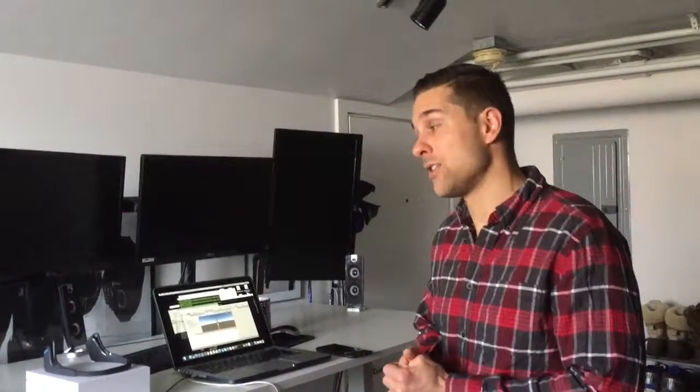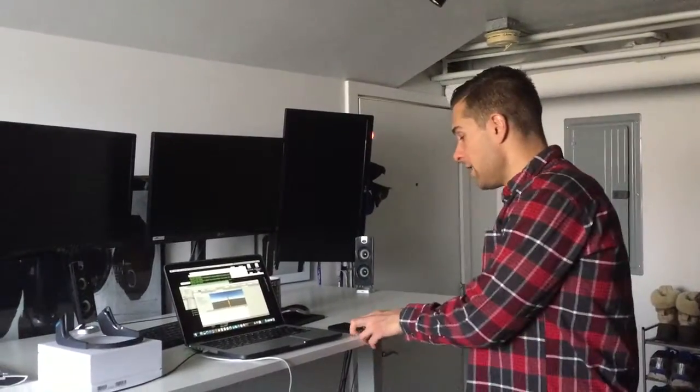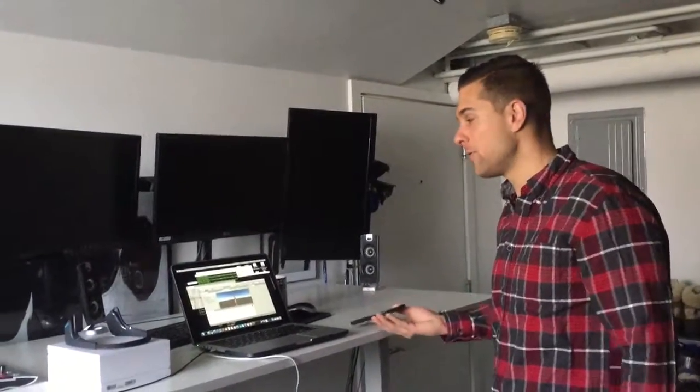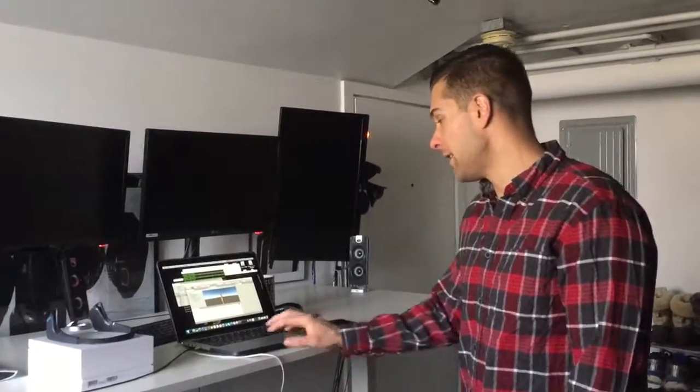The software stack here is sort of complicated. This Muse was supposed to come with an SDK that's advertised on the website. It wasn't until it came in and you go through to download the SDK that it says it only works with the previous model. So I have to use a little third-party app that reads the raw brainwaves, sends it via OSC to a little Muse Lab program that processes it, and that gets sent to a Python script we wrote that's also our feature extractor.